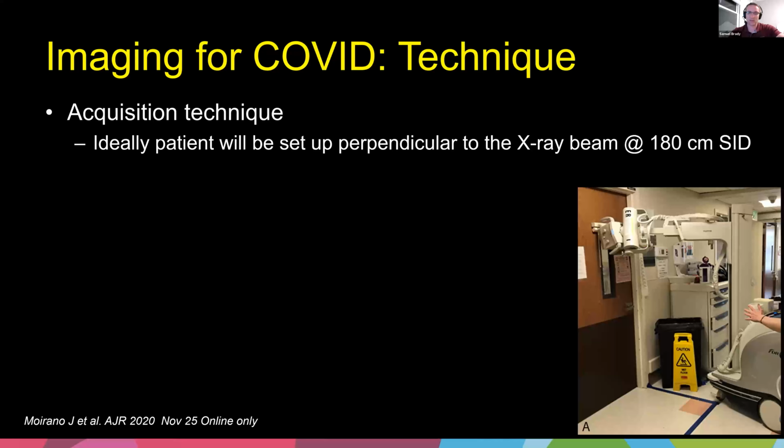So there's a couple more things. And now, this was the question that was asked a little bit ago from our friend in Vietnam. He mentioned, what happens if we tilt it a little bit? Well, I said, do your best to keep the detector and the radiation beam perpendicular. Like I said, that's a perfect scenario.